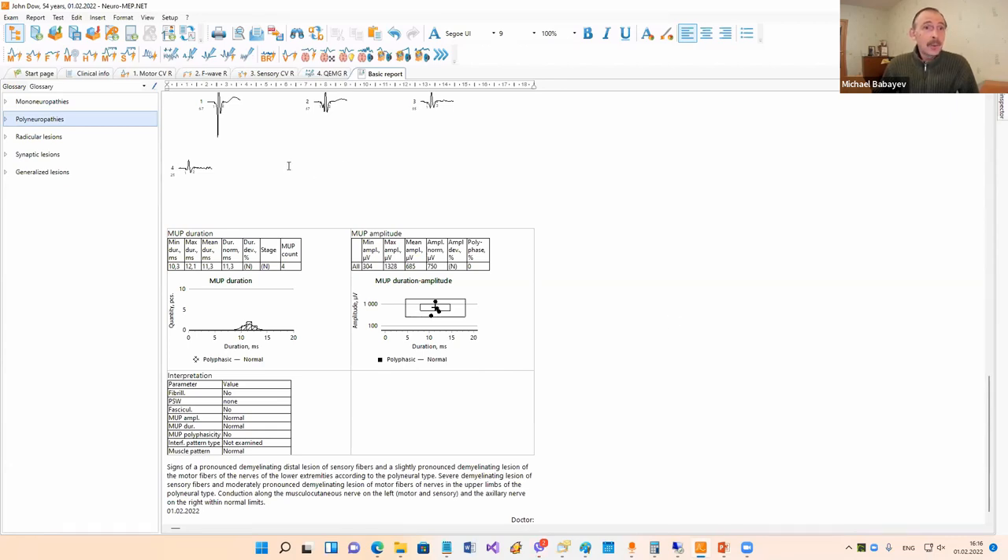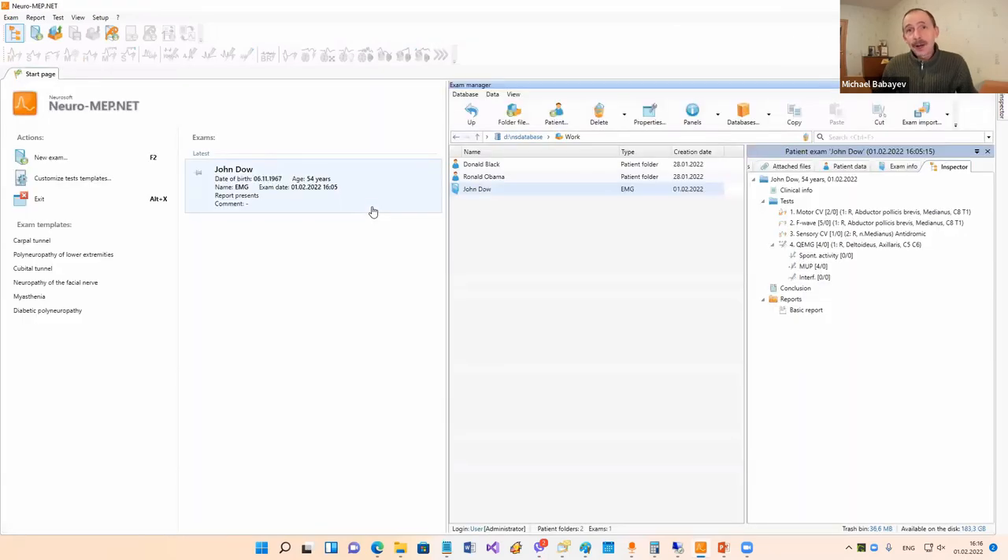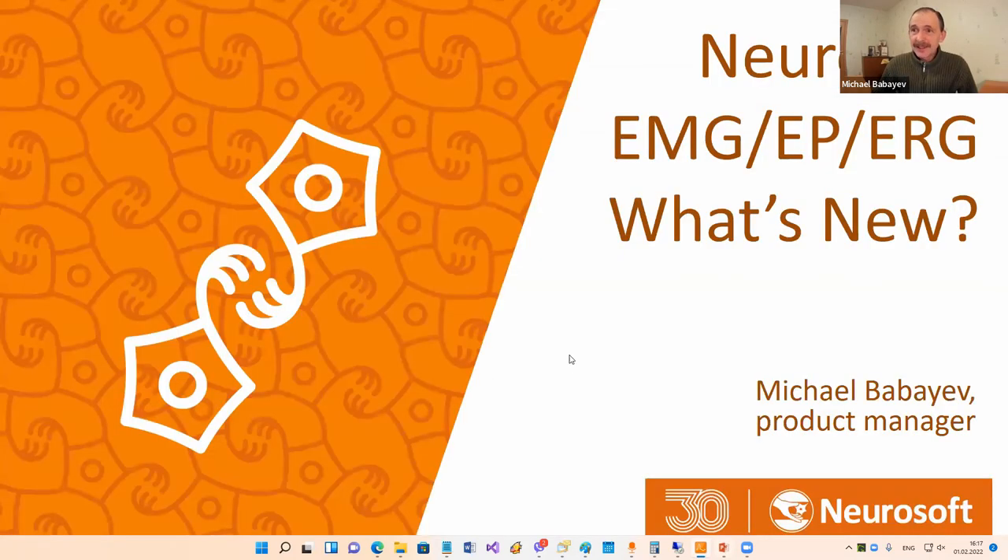After that, our task is to print the report, then save it, and close the examination. That is how to do an examination in our system - it is very easy. Now let's go to the biggest part of our presentation: what's new in our system.